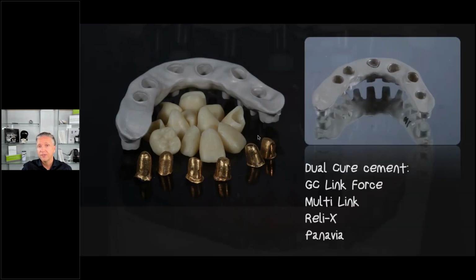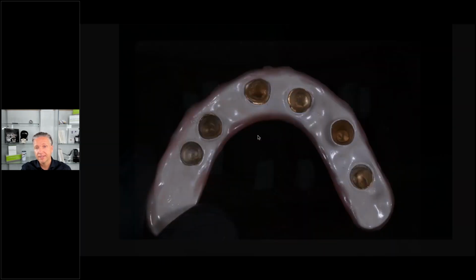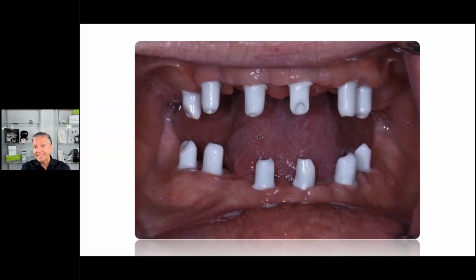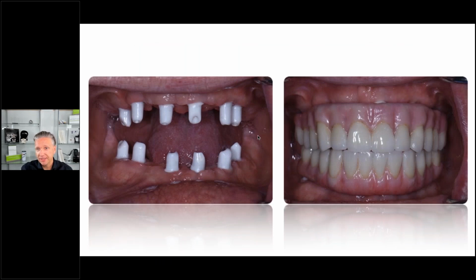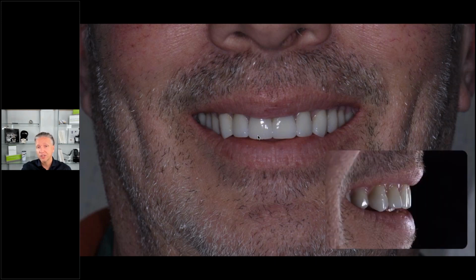And here we see the final case. So these are lithium disilicate crowns on the Pecton, finalized with a pink composite. And you see here the galvano in there, and this in the mouth, and seated. Very happy patient. I did this restoration a few years ago. Patient still super happy. No repairs at that point because we have no wear on denture teeth. There are no denture teeth. There are crowns, and it's just a very cool restoration. Very good longevity, and the weight is just very, very minimal.